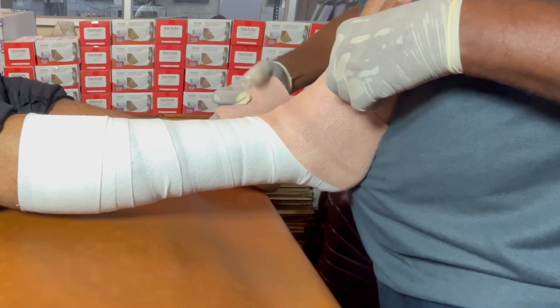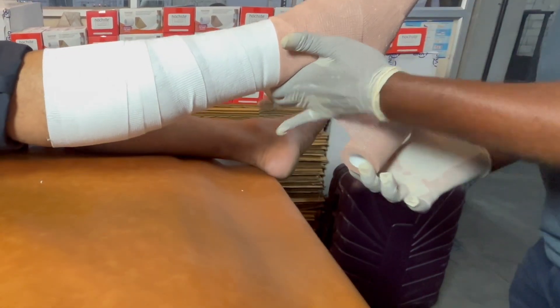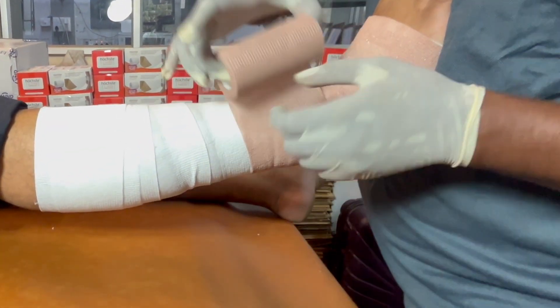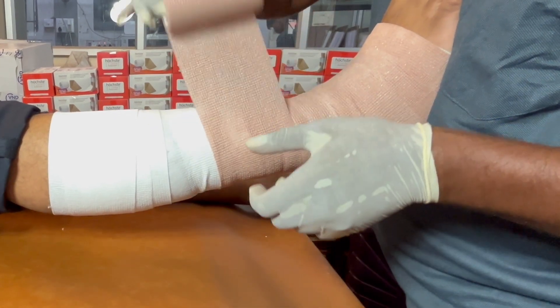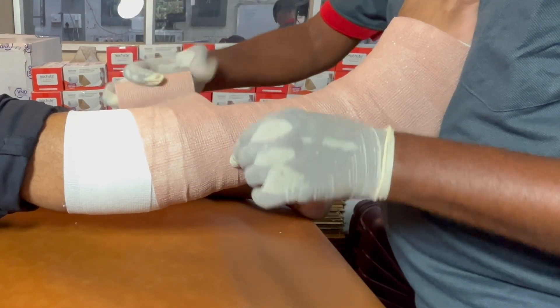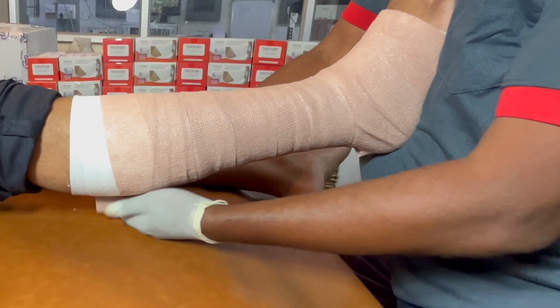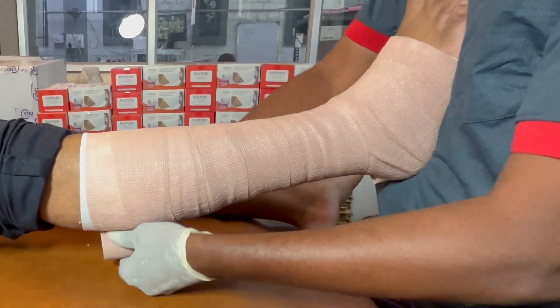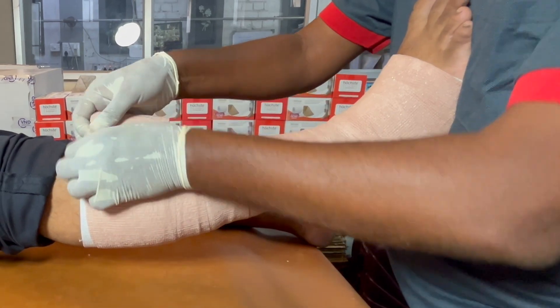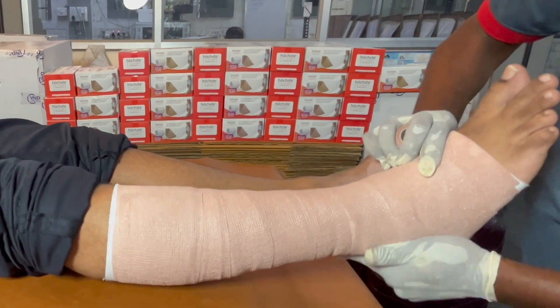Flow the second winding across the top of the foot and bring it around the back of the heel, covering the posterior surface of the foot using the figure-8 technique. Bring the roll back over the top of the foot and across the bottom of the foot until the heel is covered. Proceed up the leg with 50% overlap and 50% stretch, covering the entire inner layer. Cut off any excess material, then gently press and conform the entire surface.